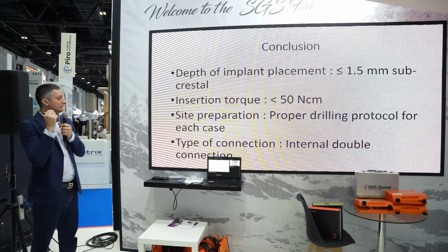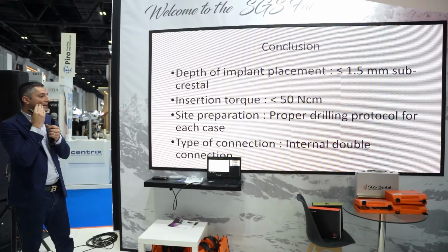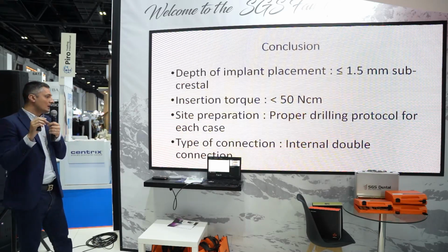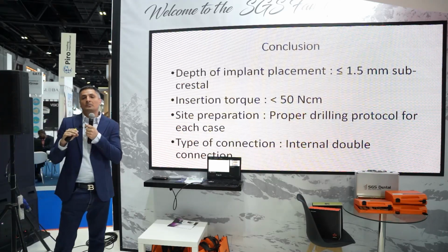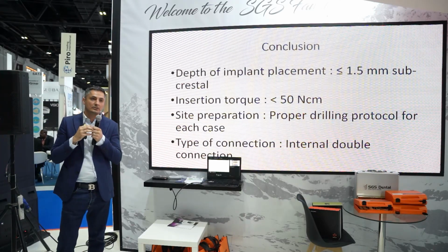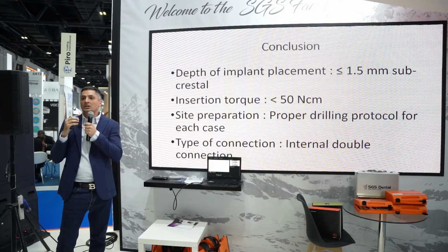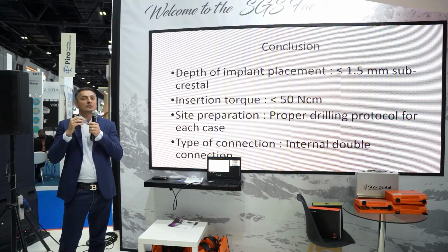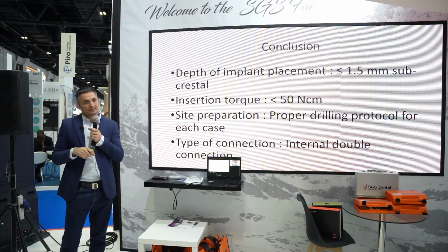And finally, the type of connection. Be sure that we have to use the double connection now. No more place for the normal connection. The double connection is a revolution for our stability, for the bone stability around the implant.